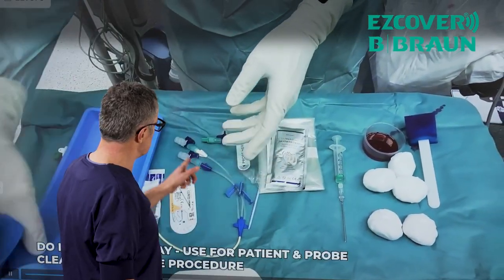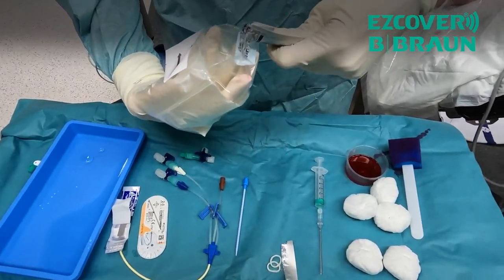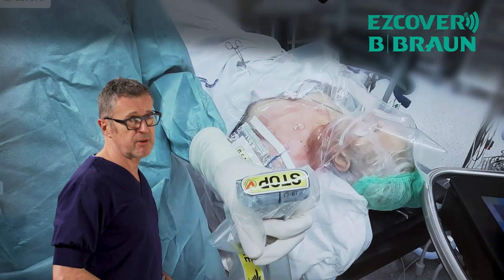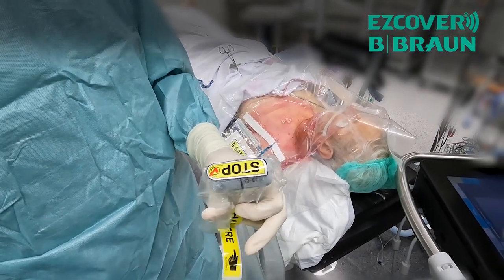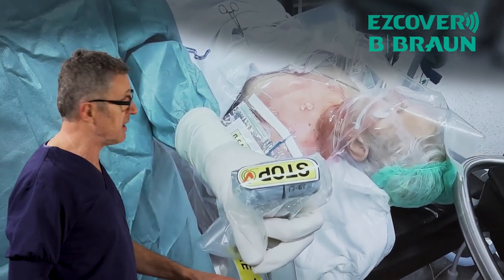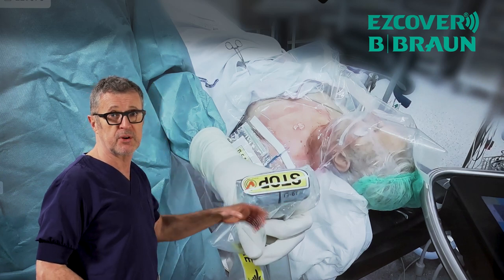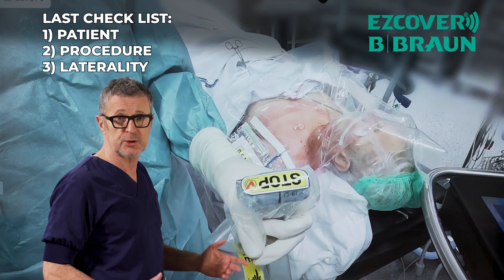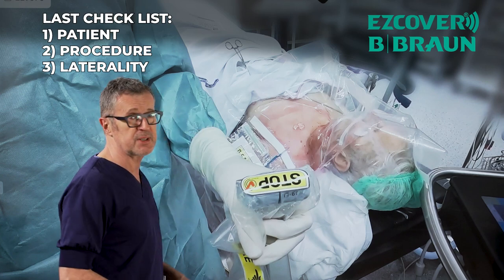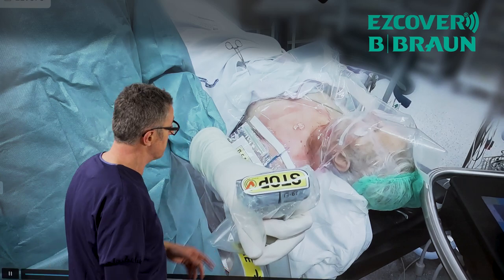This piece is also used to wrap and clean the probe. Clearly: hand here, probe here, so you never make a mistake — just pull here. It's a very seamless and quick process. We have a stop sign so that you cannot get any images until you remove it — that's a physical barrier at the point of care. This is the time where you first assure the correct patient, correct procedure, and correct side, and only then remove the sticker and place it in a visible place so the whole team knows the timeout has been performed.